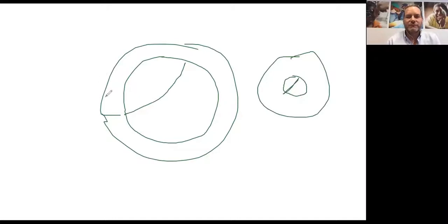So what I do, if I didn't have a vitrector and I had to treat this patient, is keep them dilated all the time. I would do an aphakic refraction through this part, and then fit them with aphakic spectacles. That would be a way to make them functional, because over here there's so much astigmatism and myopia, it's just impractical. But if you stay over here in the aphakic part, the zonules are so few and far between that they don't interfere with the vision. You can then have them wear aphakic glasses and be functional.